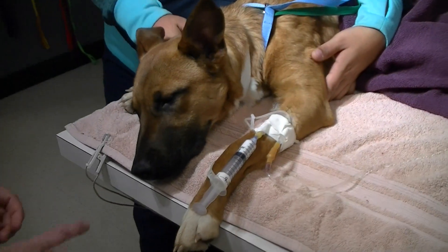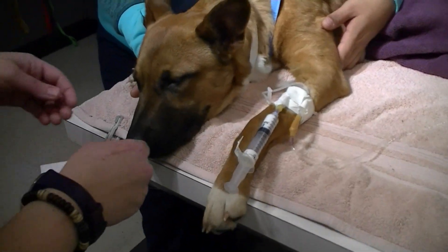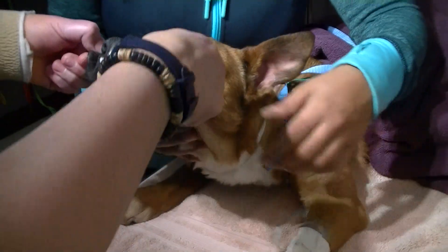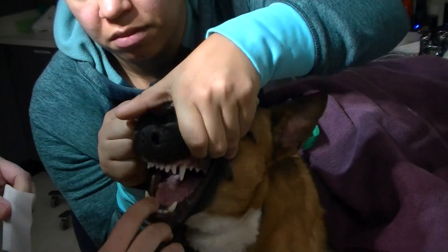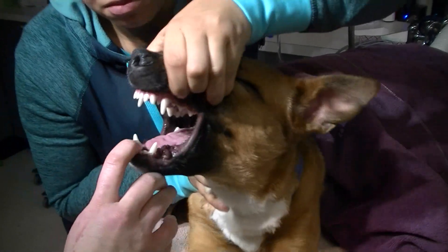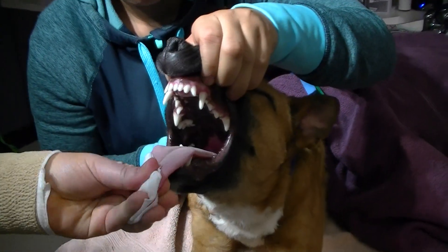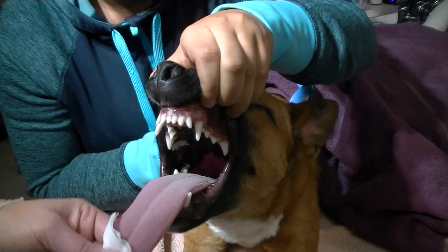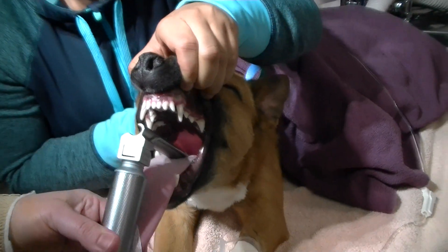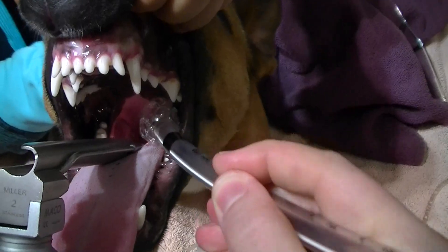There it is — heavy head, reduced palpebral, reduced jaw tone. Definitely reduced laryngeal reflex. If you can pull the tongue out, then they're ready to be intubated. If they struggle for their tongue, then they will need more anesthesia.